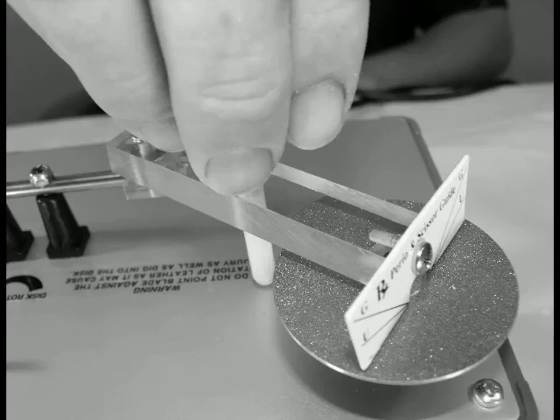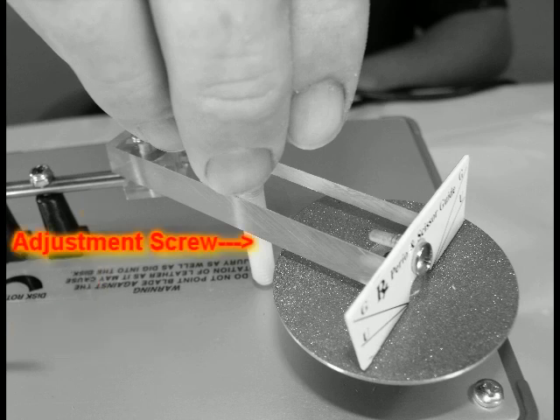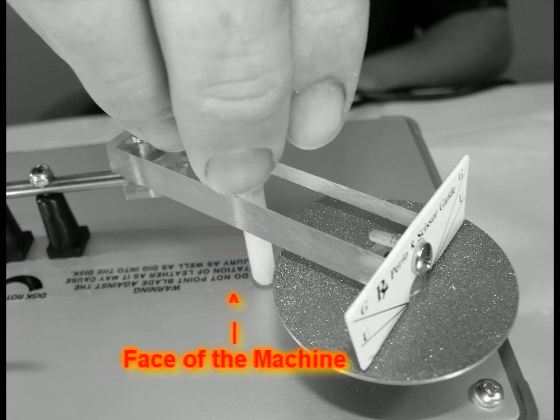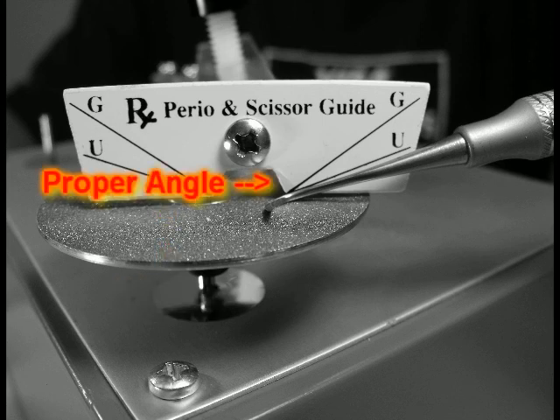Next, apply the disc Perio guide. You want to push the disc Perio guide onto the metal bar in the middle of the instrument. Adjust the screw on the disc Perio guide so that it is resting firmly on the face, and the face of the disc Perio guide is not resting on the disc. You want the face of the disc Perio guide to be millimeters above the disc itself, thus allowing you to line up the proper angle for your hygiene instruments.